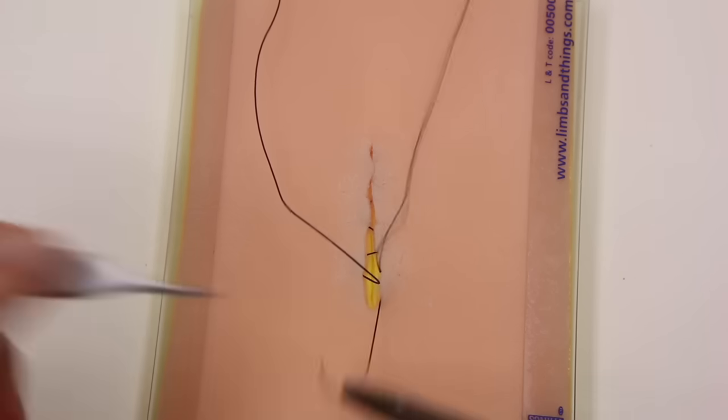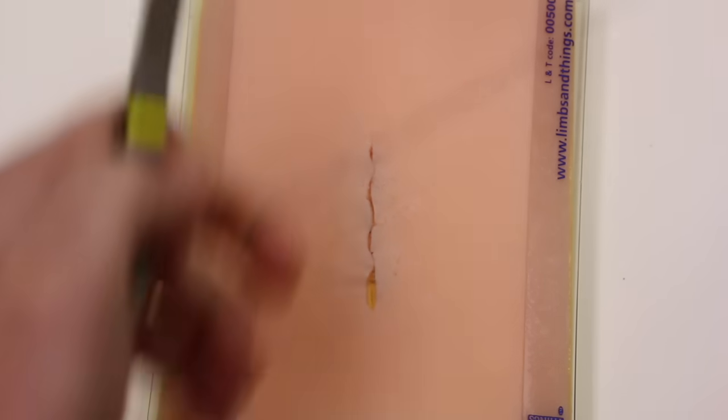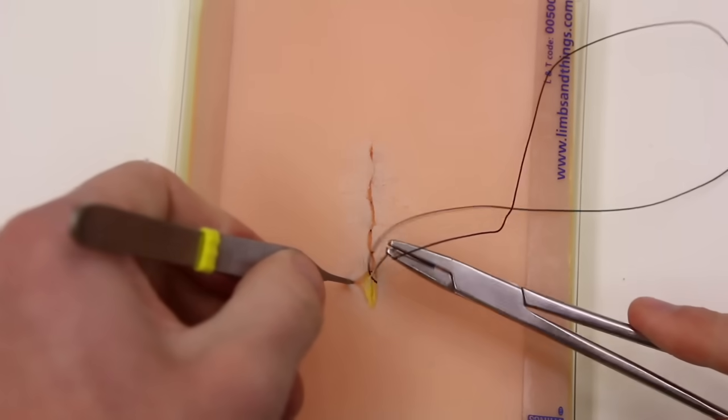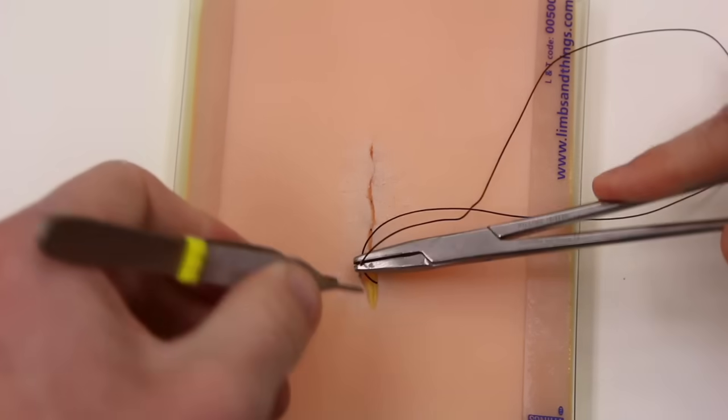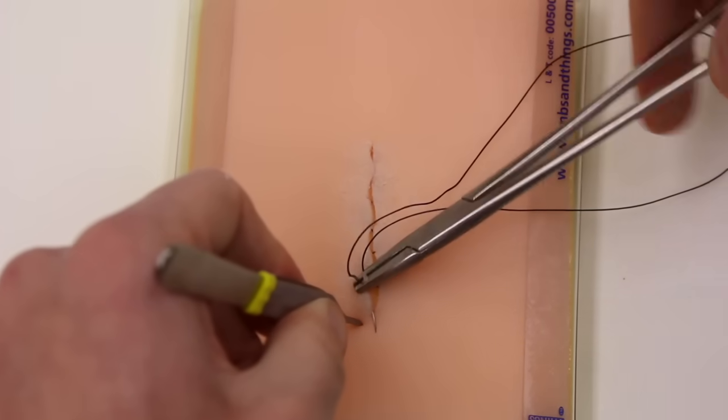So as you're nearing the end, taking smaller bites. One last stitch here at the skin edge. Going out through the apex of the incision.